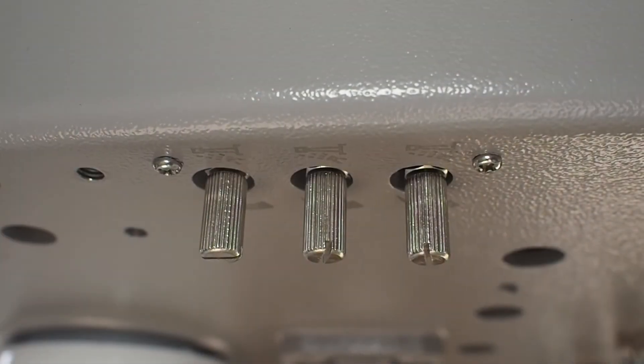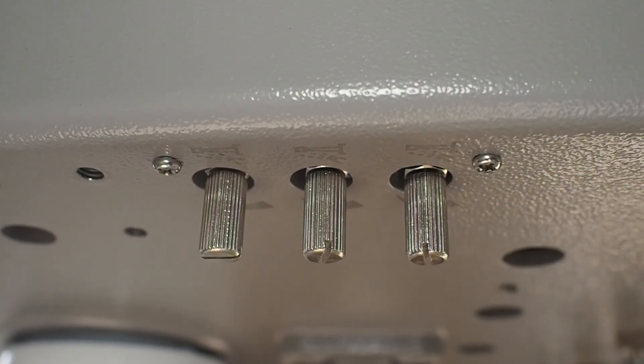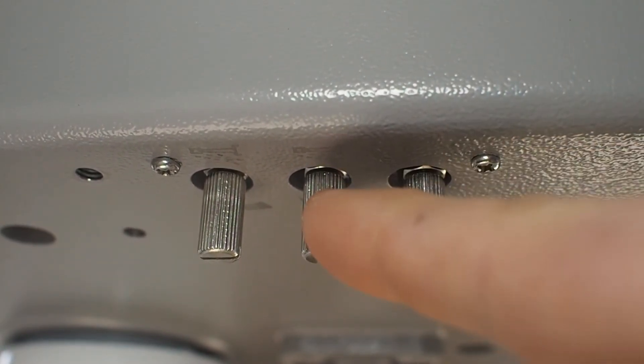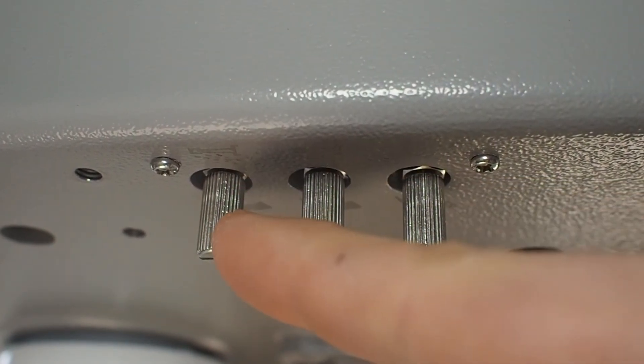There are three knobs. This one controls the first micromotor air. This one controls the second micromotor air. And this one the turbine air.